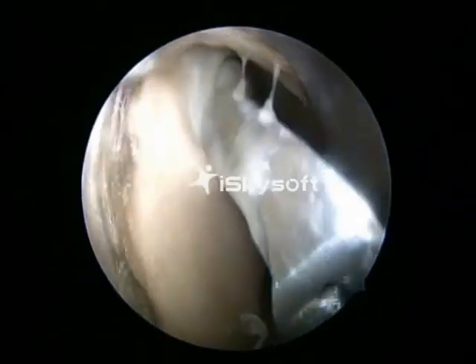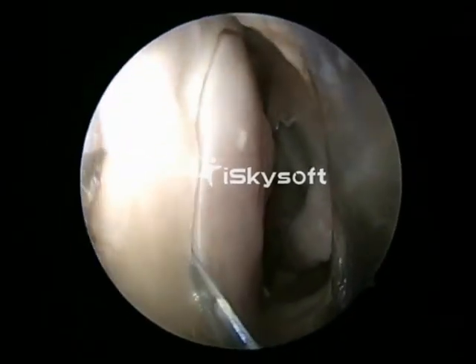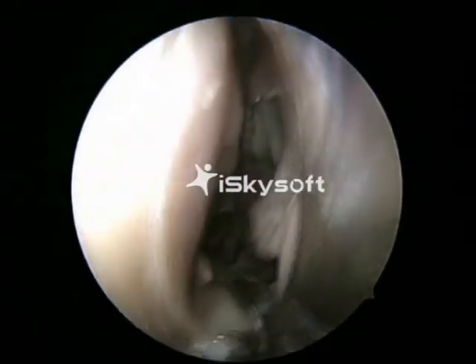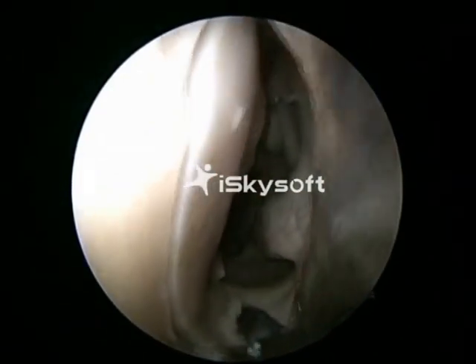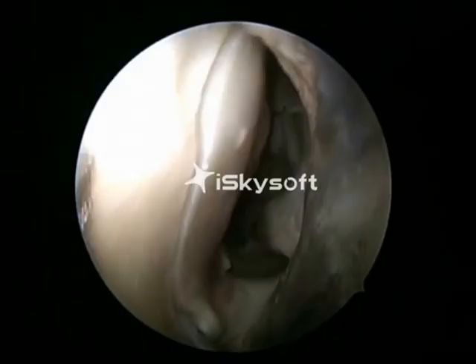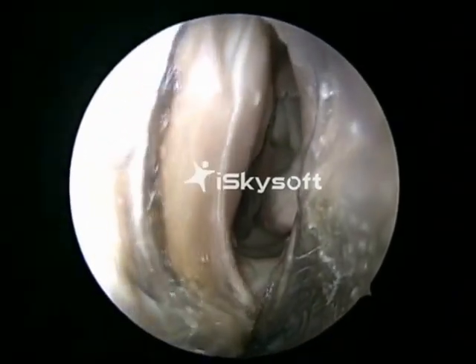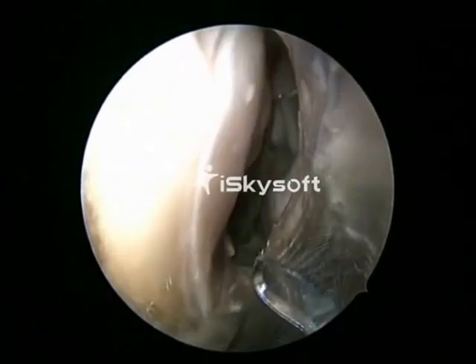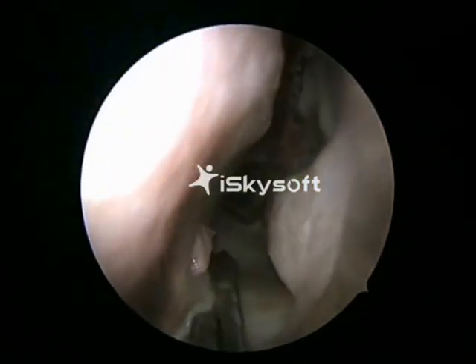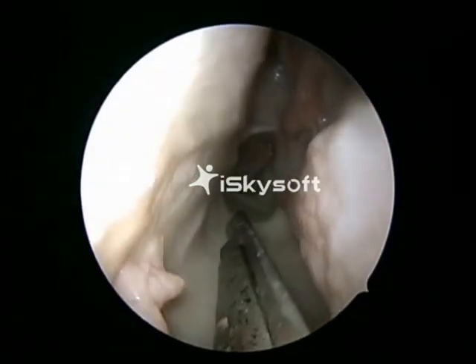Once the two incisions are connected, the flap is elevated in a submucoperichondrial plane, as we do in septal correction. That is the incision on the floor being given.